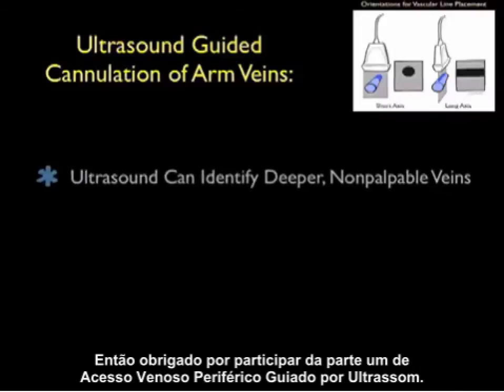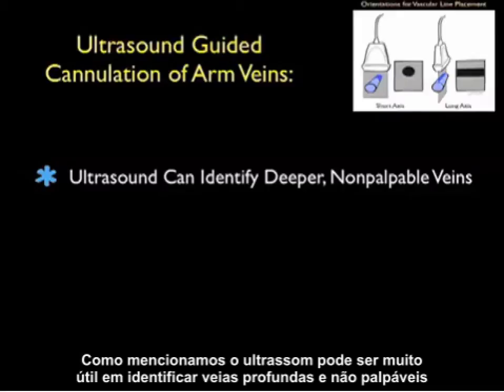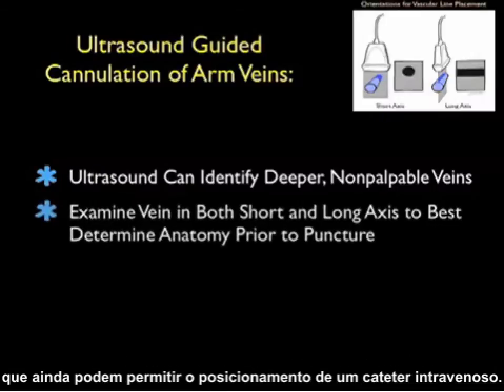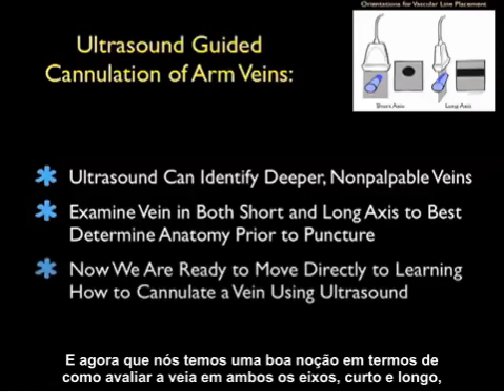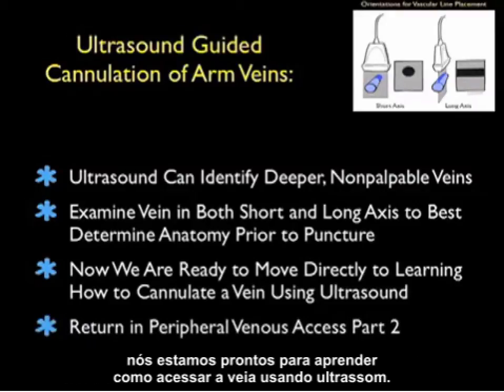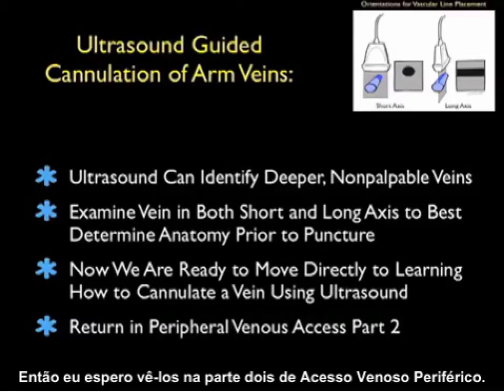Thanks for tuning in to part one of ultrasound-guided peripheral IV insertion. Ultrasound can be very helpful in identifying deeper and non-palpable veins that still allow placement of an intravenous catheter. We'll be looking at the vein in both short and long axis views to determine the anatomy prior to a puncture attempt. Now that we have a good sense of how to look at a vein in both views, we're ready to move to learning how to cannulate the vein using ultrasound. I look forward to seeing you in part two of peripheral venous access.